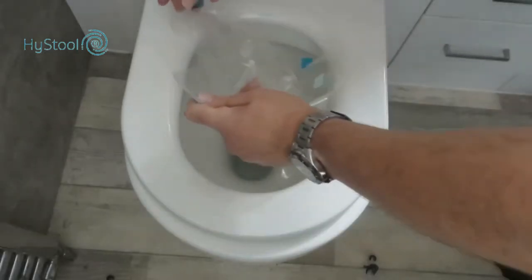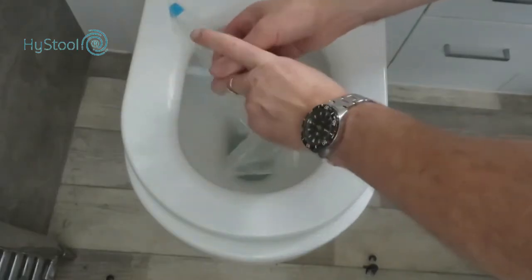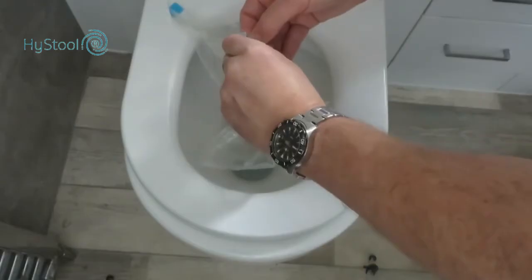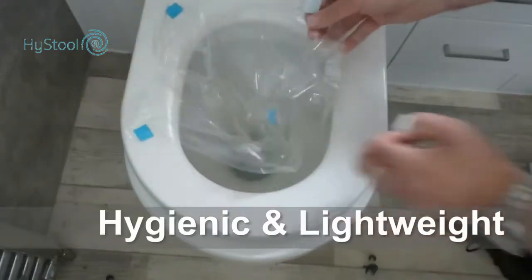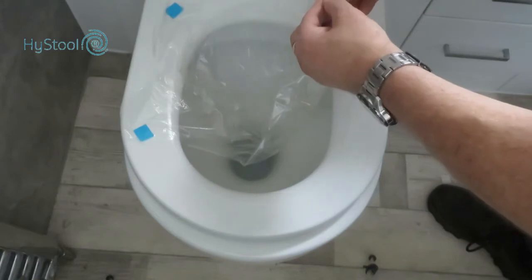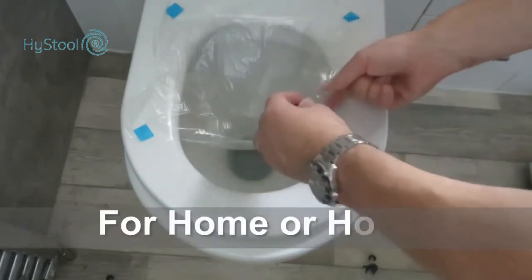Simply attach the bag to the toilet using the four stickers at the top. Peel off the backing paper and attach the bag towards the rear of the toilet. There is no need to reach inside the actual toilet bowl, and the procedure is easily completed by somebody at home or by professional staff in hospitals.